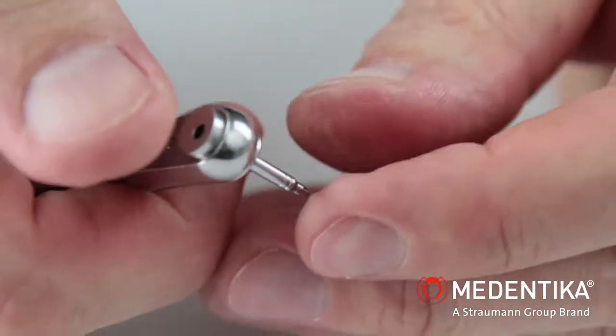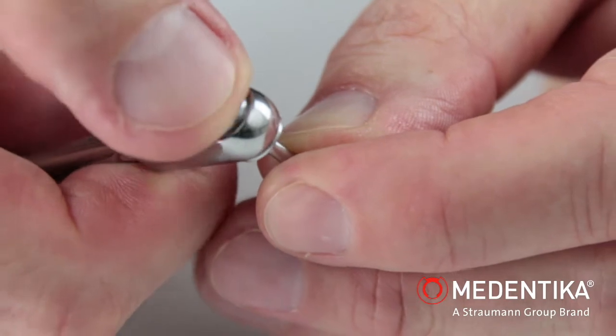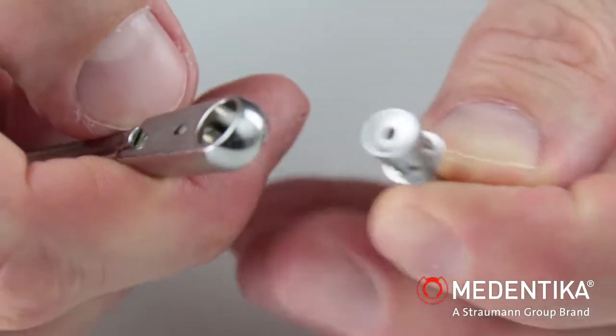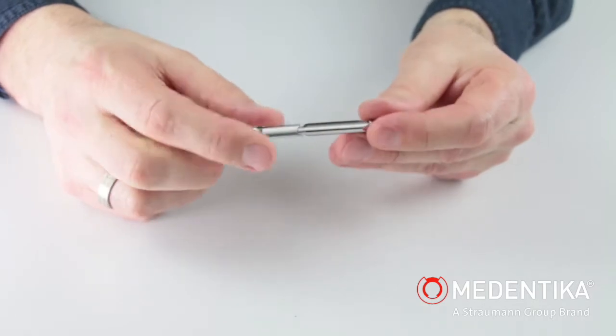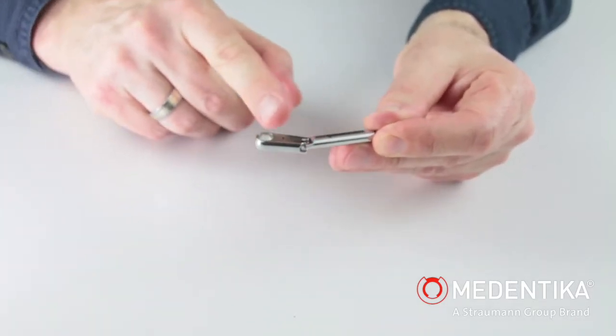The instrument is removed again from the ratchet by applying light pressure with the fingertips. When using a torque, the ratchet head signals when the torque is reached by bending.